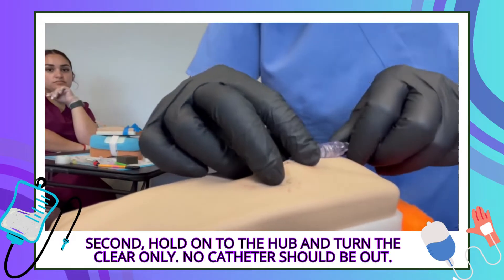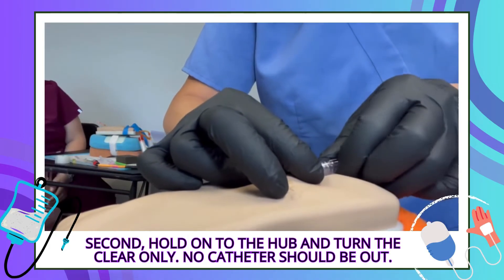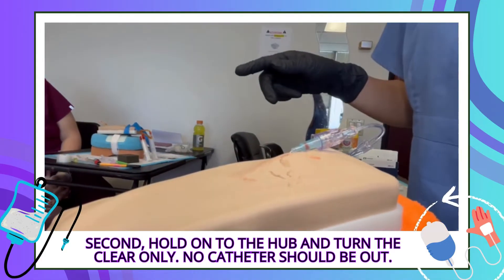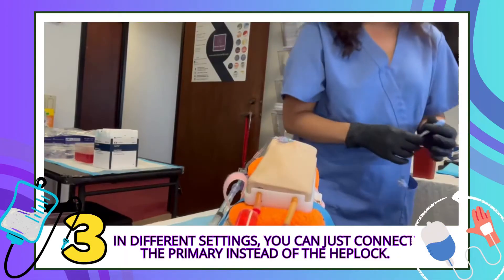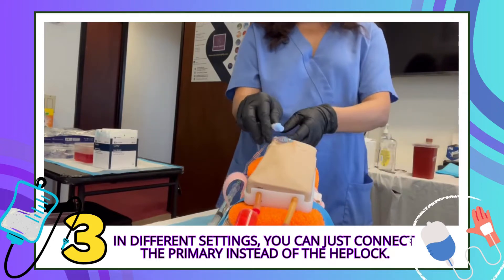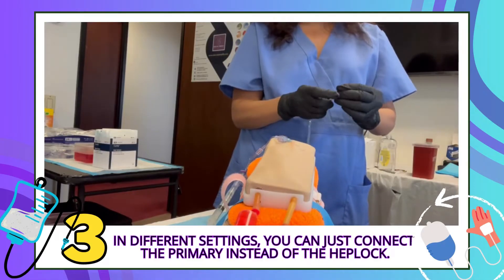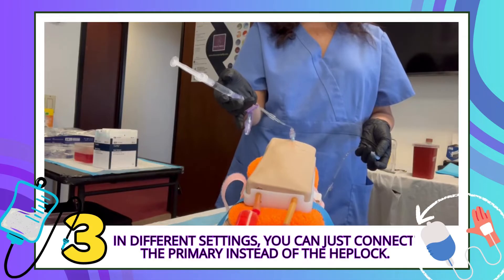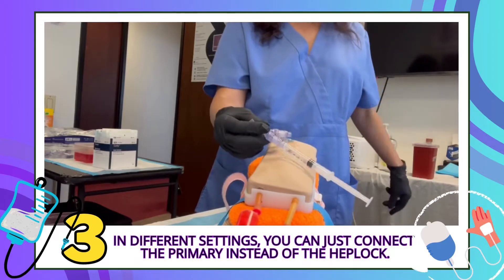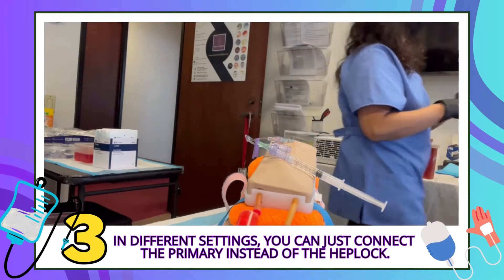If you turn the hub, everything will come out. So you hold on to the hub and turn the clear only. No catheter should be out — if the catheter is out, that means you turned the hub. In different settings you might connect the primary instead of the hep lock. But in most inpatient stays of about three days or more, we use the hep lock because you can just disconnect it and your patient can walk around more independently.